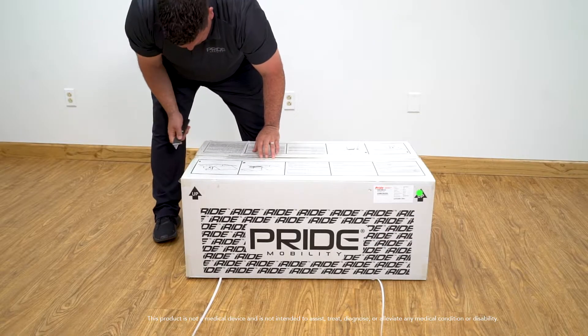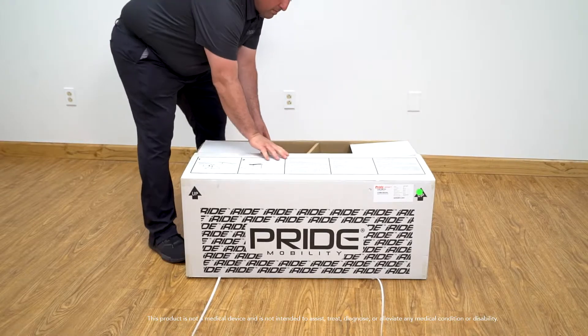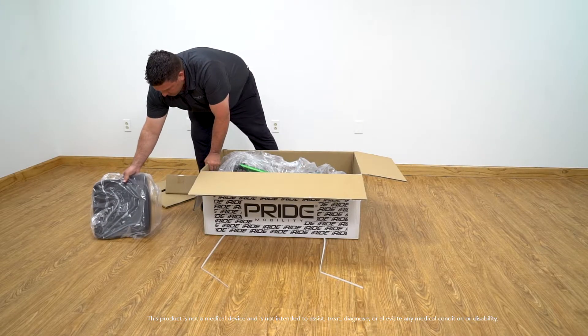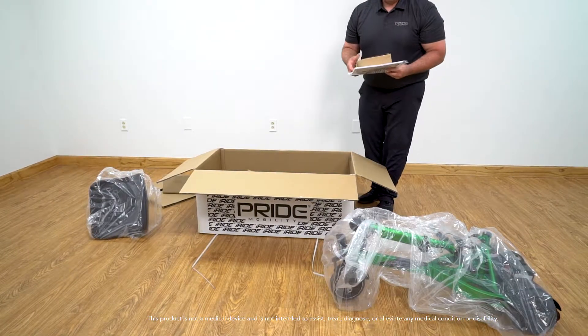When the iRide is shipped, it will come in one box. Open the box and remove the iRide. You should have the following inside the box: a seat, the iRide, a battery charger, and the owner's manual.